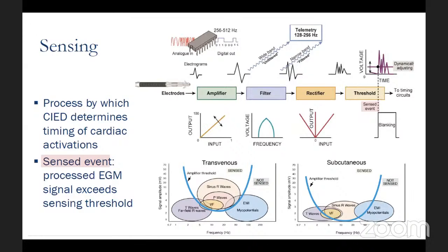Can I just ask, is there a difference between an abandoned lead in the ventricle and biventricular pacing with an atrial lead? Let's say both devices will have 3 leads. Does that make a difference whether the patient can go into the scanner or not?